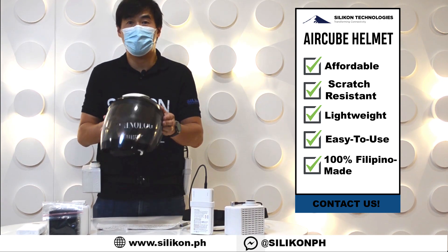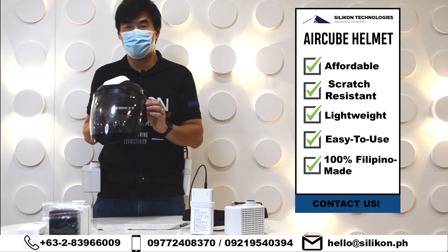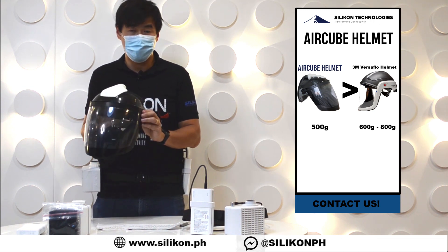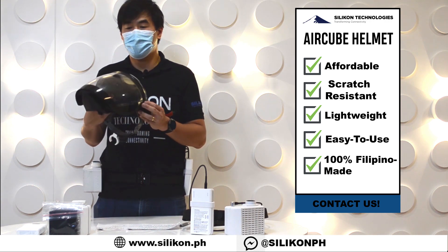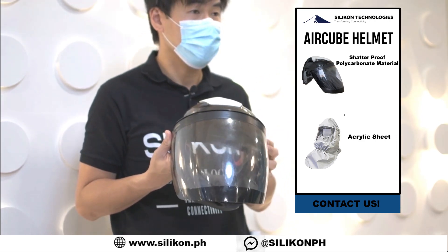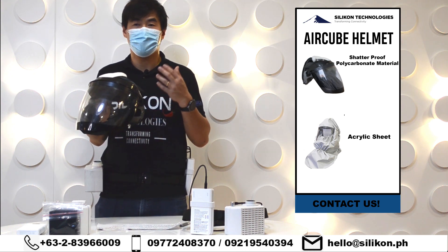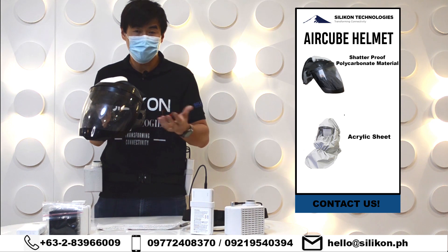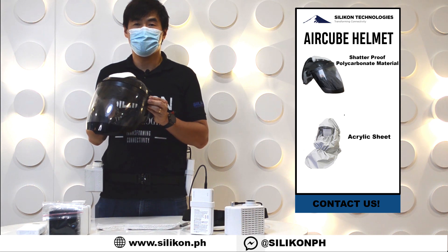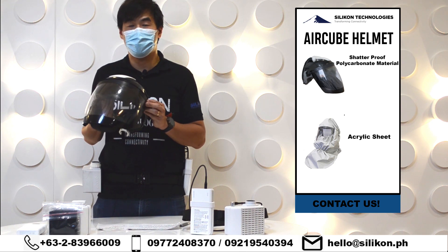This is what we have with our Air Cube helmet. Unlike the 3M VersaFlow helmet which weighs around 600 to 800 grams, this one only weighs 500 grams. The transparent material is made of polycarbonate — a hard material — unlike our hood, which is made of acrylates or a certain form of acrylic sheet. This hard plastic polycarbonate is also a bit scratch resistant and more sturdy compared to the hood version.